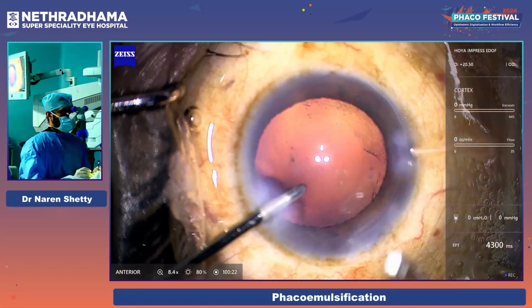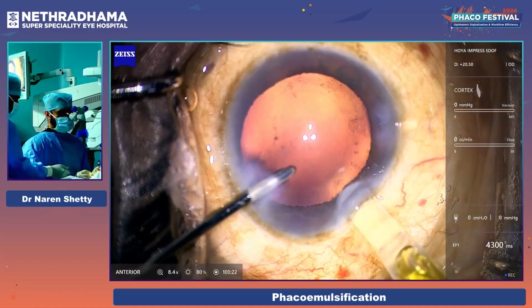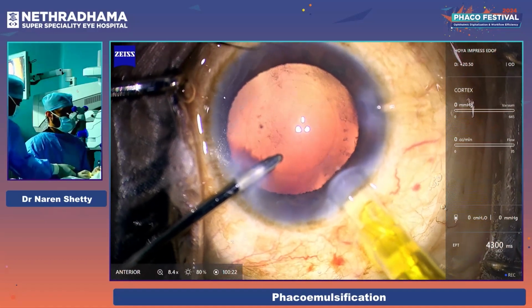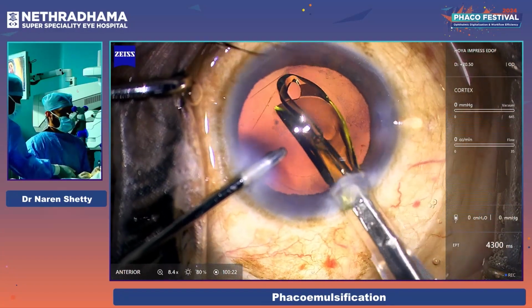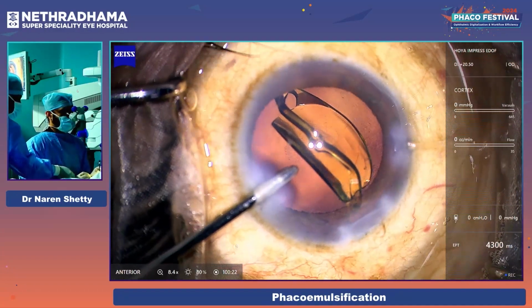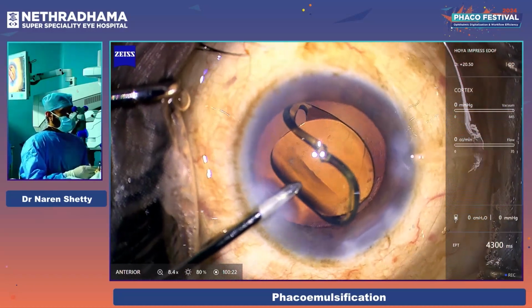So what I do is I do it under irrigation itself. My assistant rotates it for me, and this is all under irrigation itself. So it's a very controlled way of delivering. Once that is done, what I do is, viscoelastic on the cornea, please.